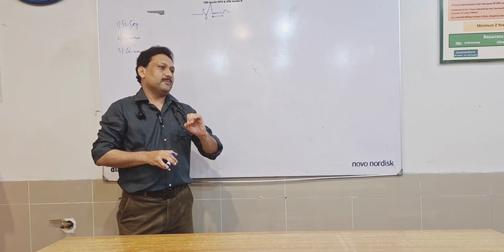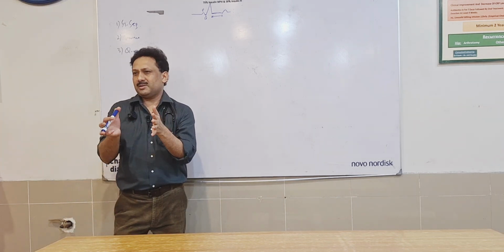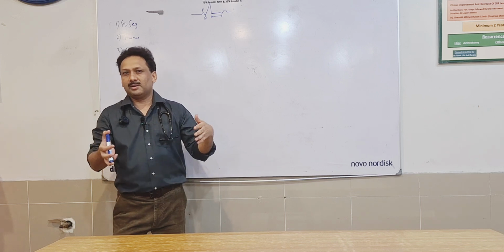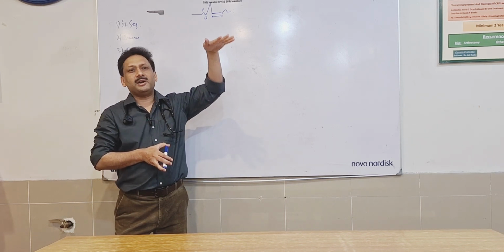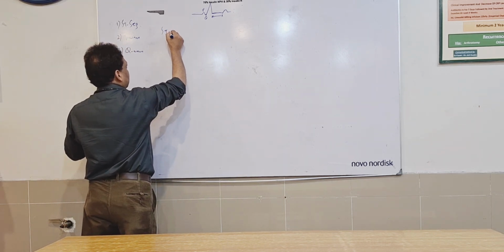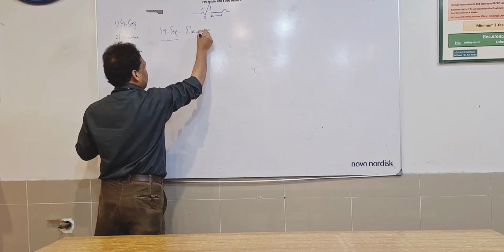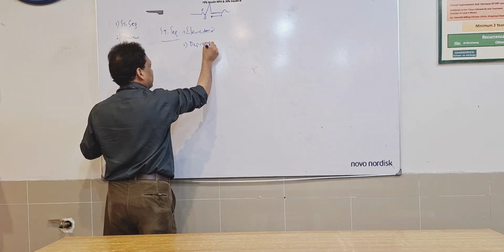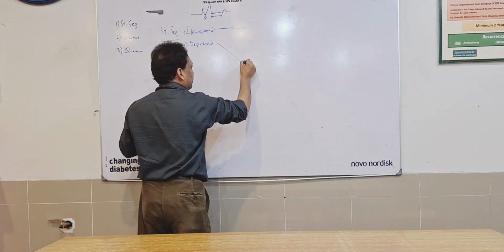If we have to discuss anything related to these three things, either the ST segment will be normal or it will be abnormal. And if it is abnormal, it will be either elevated or depressed. So there are two abnormalities in the ST segment. And both have different differentials.